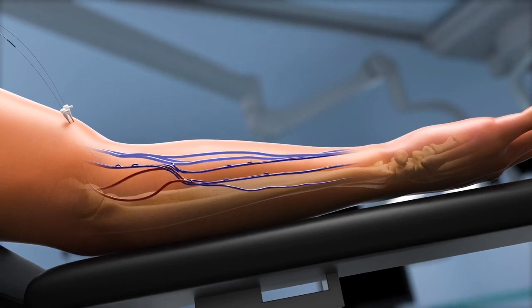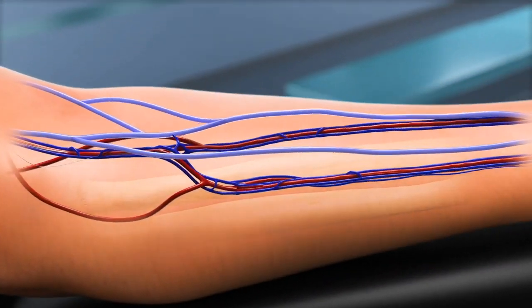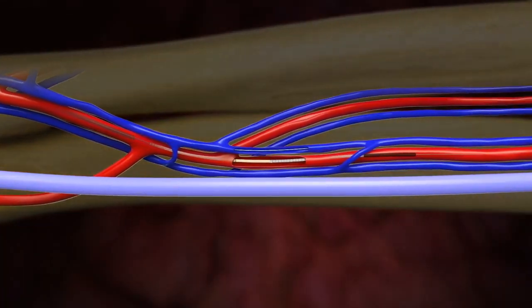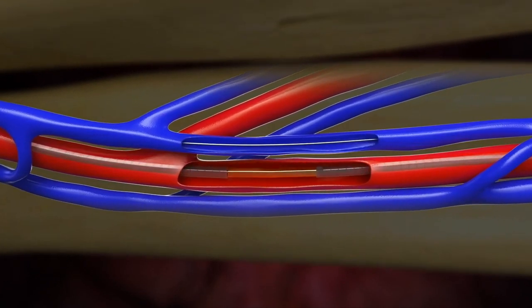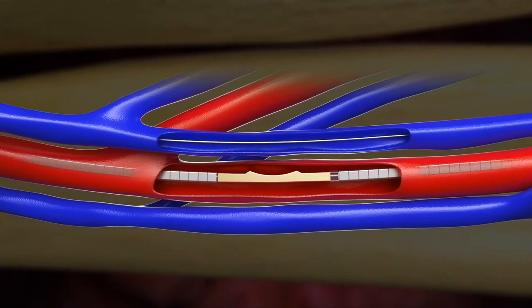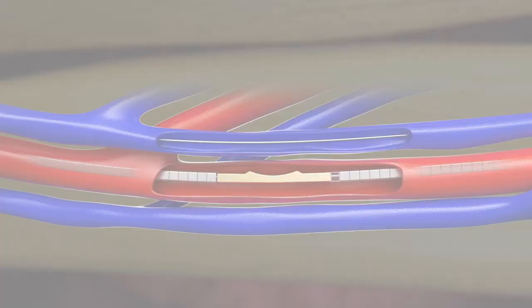After venous and arterial access have been achieved and guide wires are in place, advance the arterial catheter over the guide wire and through the arterial sheath into the brachial artery. Under fluoroscopic guidance, advance the catheter to the target EndoAVF site. Next, rotate the arterial catheter until the illumination of the rotational indicators appear as open boxes, and the peaks of the backstop are pointed towards the target vein.